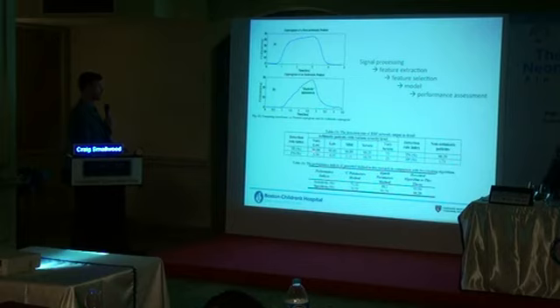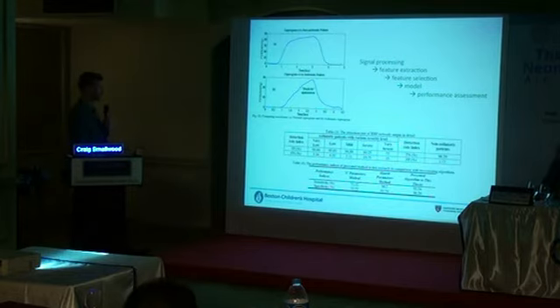And you can see here what they did was calculate the sensitivity and specificity. They looked at the stratification of severity of asthma over here. You can see the true positive and the false negative rate. So the bigger this number, the better. The smaller this number, the better. And you can see that overall it was pretty successful. And then the sensitivity and specificity compared to some other metrics of assessing severity of obstruction. So this is their performance here compared to some other benchmarks that you see in the literature.